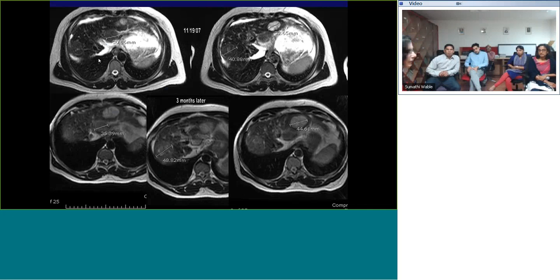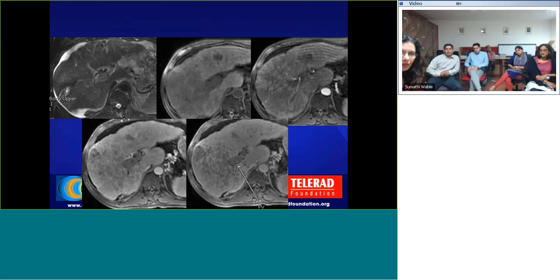And I know that you are not the ones who dictate what is done, but they showed me one case, which is what prompted me to do this talk, from somewhere where they had sent only the pre and post contrast images.